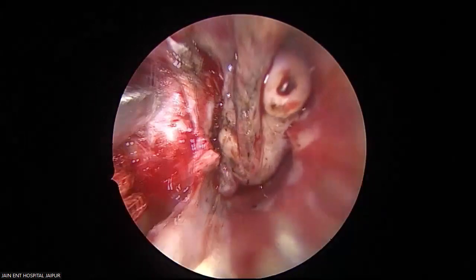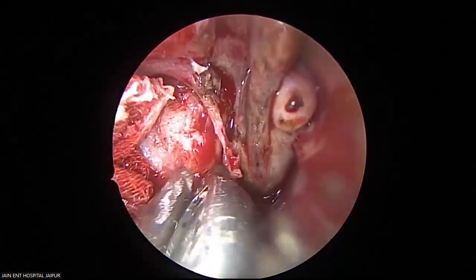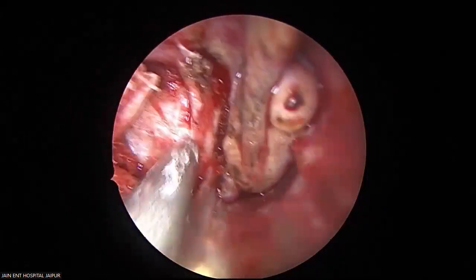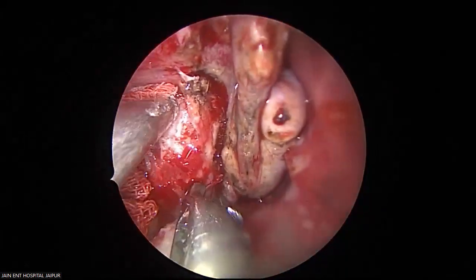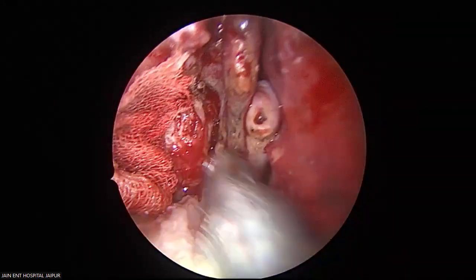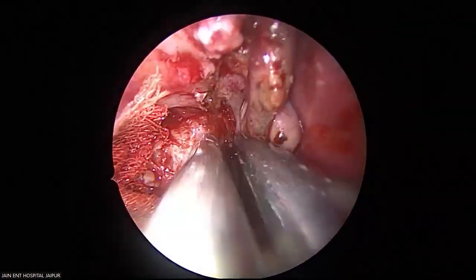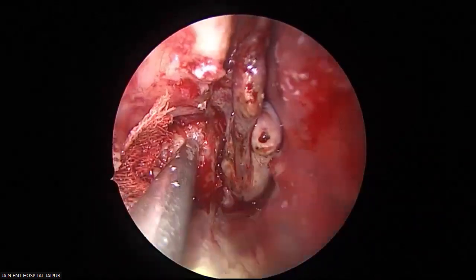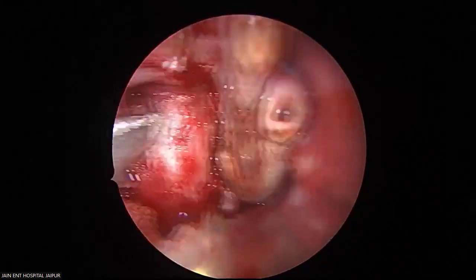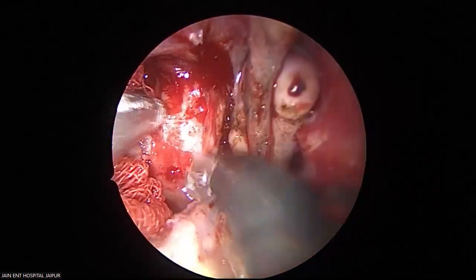So now, again, continuing the same thing. See this flushing with the posterior wall. See the posterior wall now. See the picture, posterior wall completely flush with the medial wall. No intervening bone is left. See this? This is the kind of exposure which completes this modified Denker's.